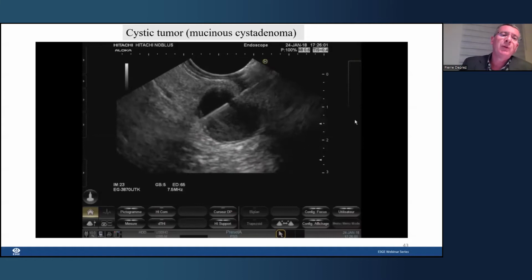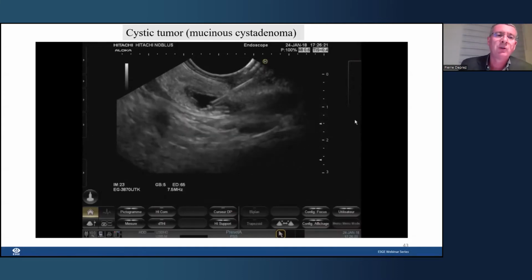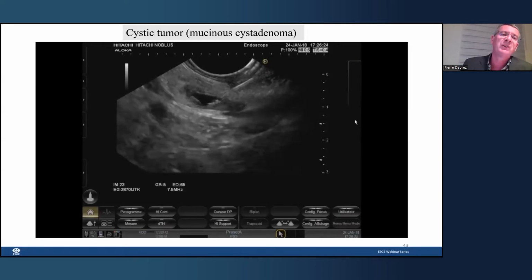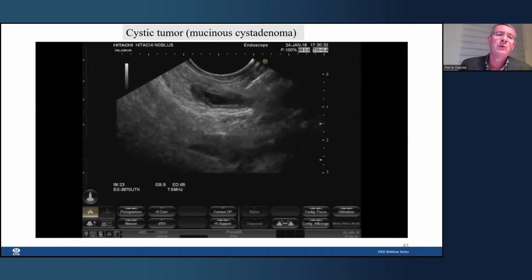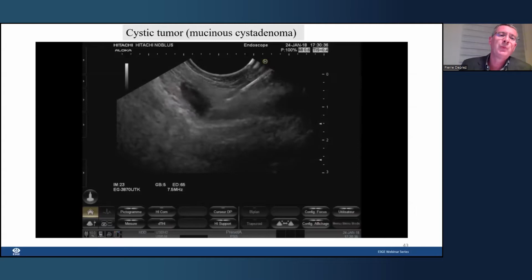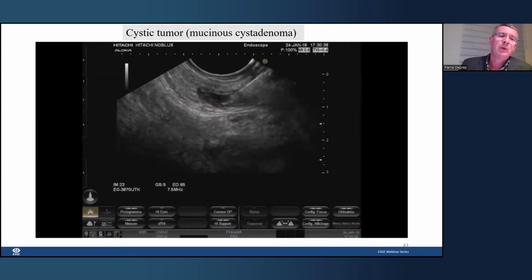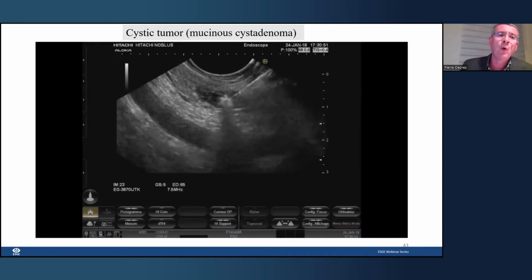And you see the technique of puncture. Well, I would not puncture through the cyst, I would keep in the cyst, of course, but the technique for radiofrequency ablation is then to suck the fluid and then to repuncture with the radiofrequency ablation probe, and then you have a higher chance to ablate the full wall of the cyst.